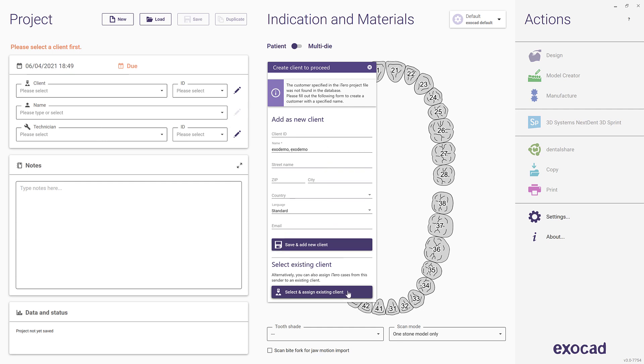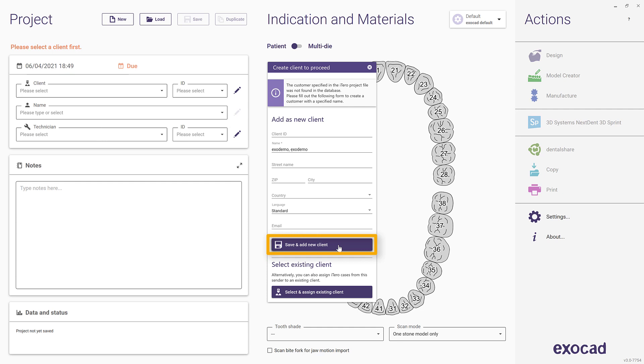For mapping, you will notice two options. For assigning a doctor to an existing client in your DentalDB database, click Select and Assign Existing Client and choose the correct client in the next screen. When creating a new client for the iTero doctor, complete the details if necessary and click Save and Add New Client.